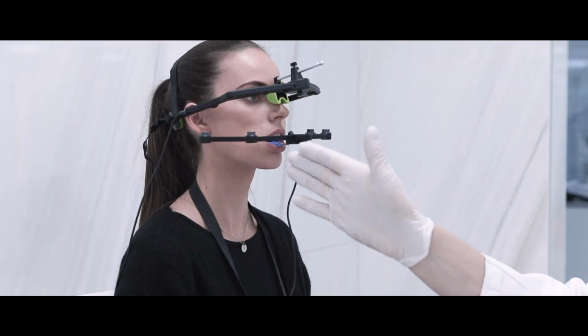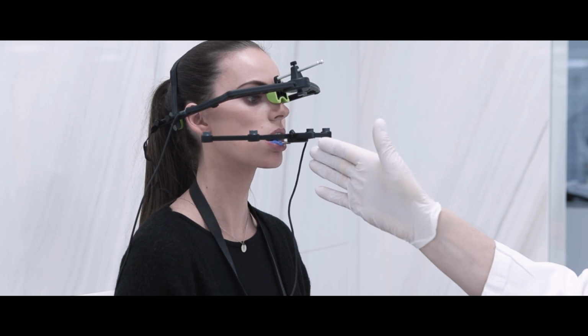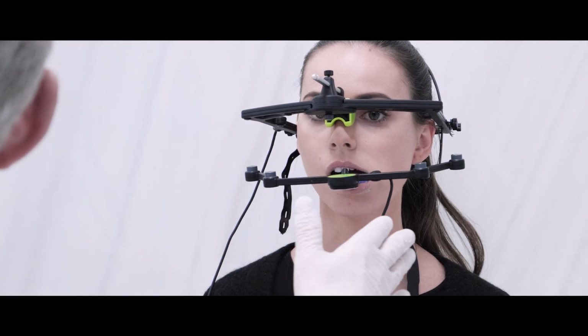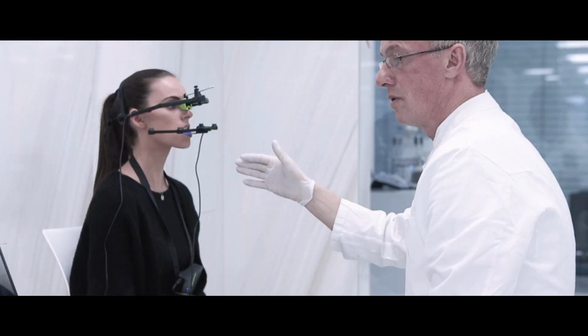The patient is asked to repeat with her jaw the movements shown by the doctor, in order to digitize them, such as mouth opening movements, protrusion, and left-right lateral movements. The plane analyzer creates a PDF document with the indications of the parameters needed to individualize the articulator.